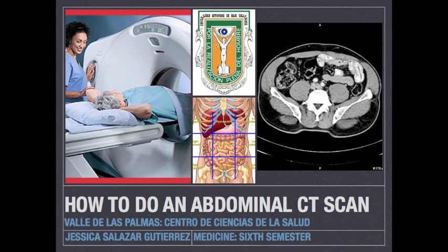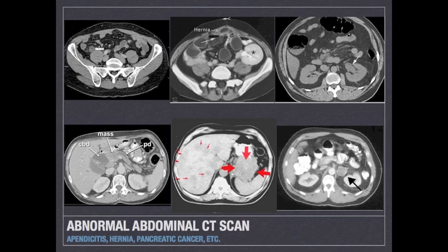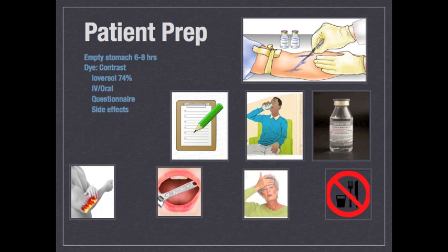This is a brief video on how to do an abdominal CT scan. An abdominal CT scan makes detailed pictures of the structures inside our abdomen very quickly. Therefore, this test may be used when we look for a cause of an abdominal pain or swelling, a hernia, a cause of a fever, masses and tumors including cancer, infections or injuries, kidney stones, appendicitis, amongst others.